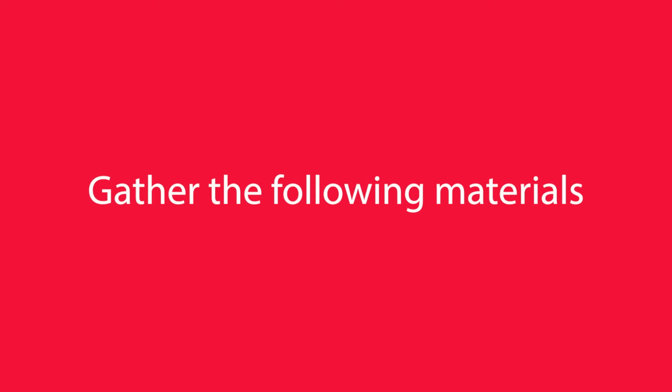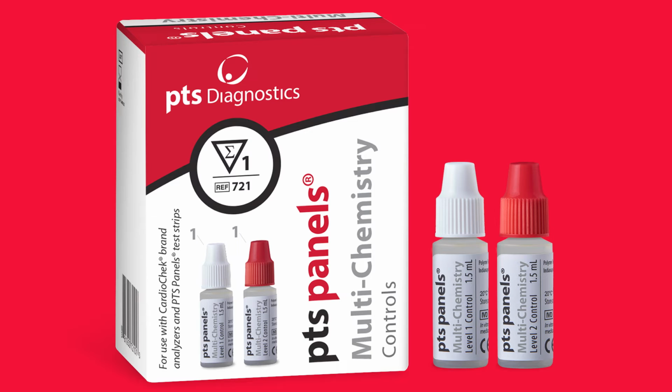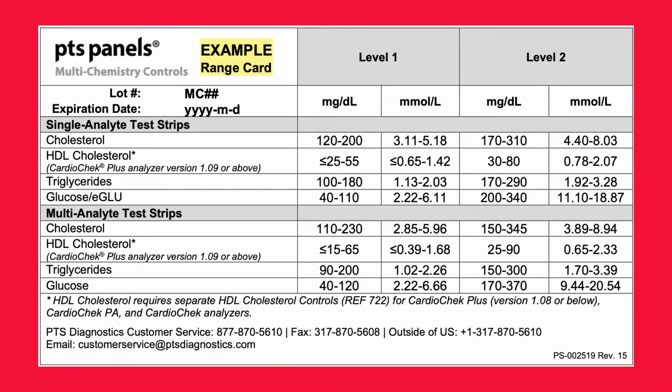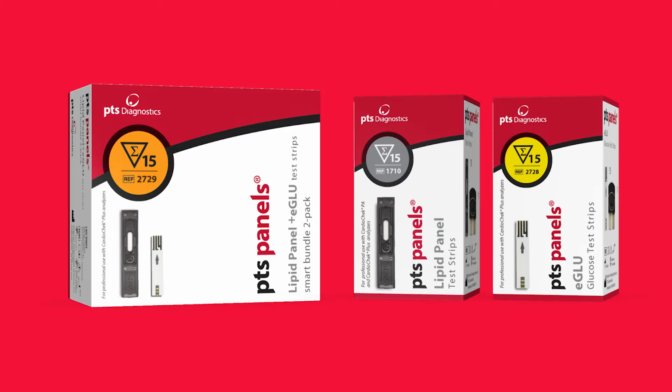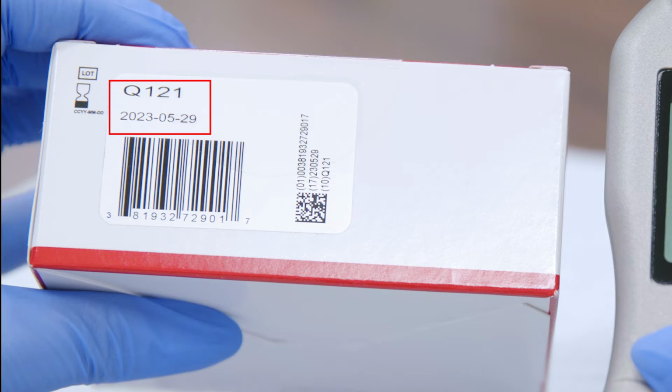Then, gather the following materials: the CardioChek Plus analyzer, the Level 1 and Level 2 multi-chemistry liquid control materials, the quality control instructions, which can be found in the box with your control materials, the quality control range card, which can be found in the box with the control materials or at ptsdiagnostics.com, the PTS Panel's test strips and memo chip. Check the expiration dates on both the PTS Panel's test strips and the control materials to make sure they have not expired.